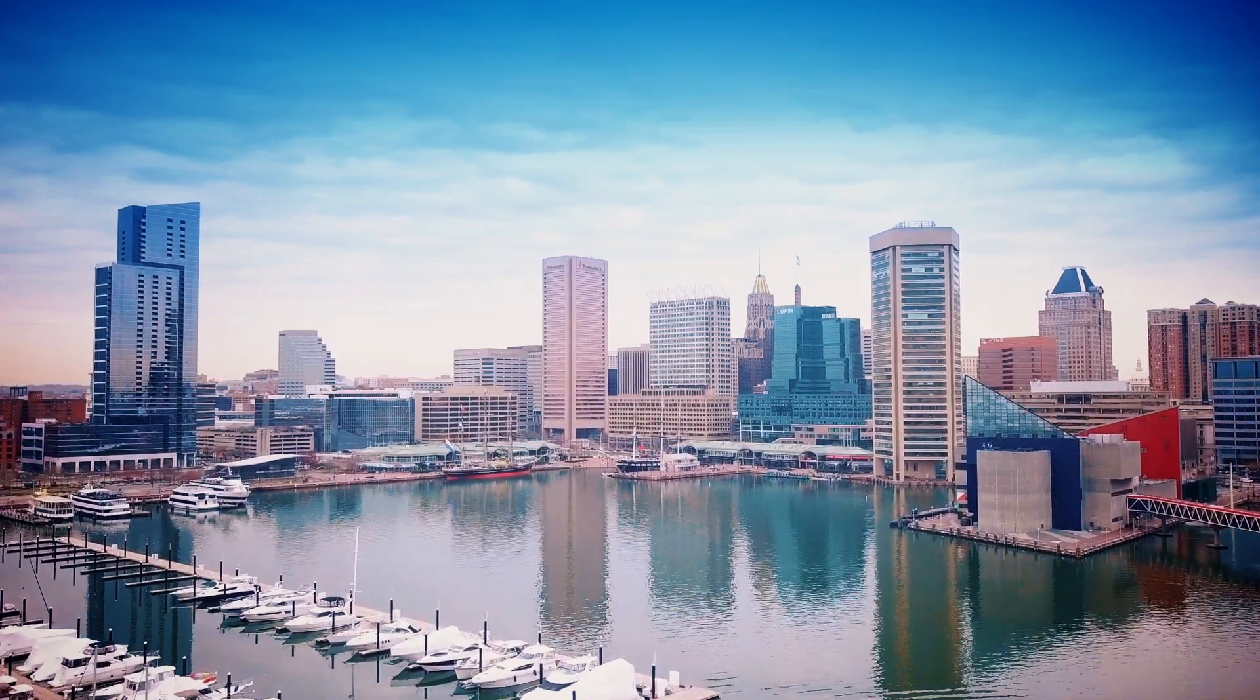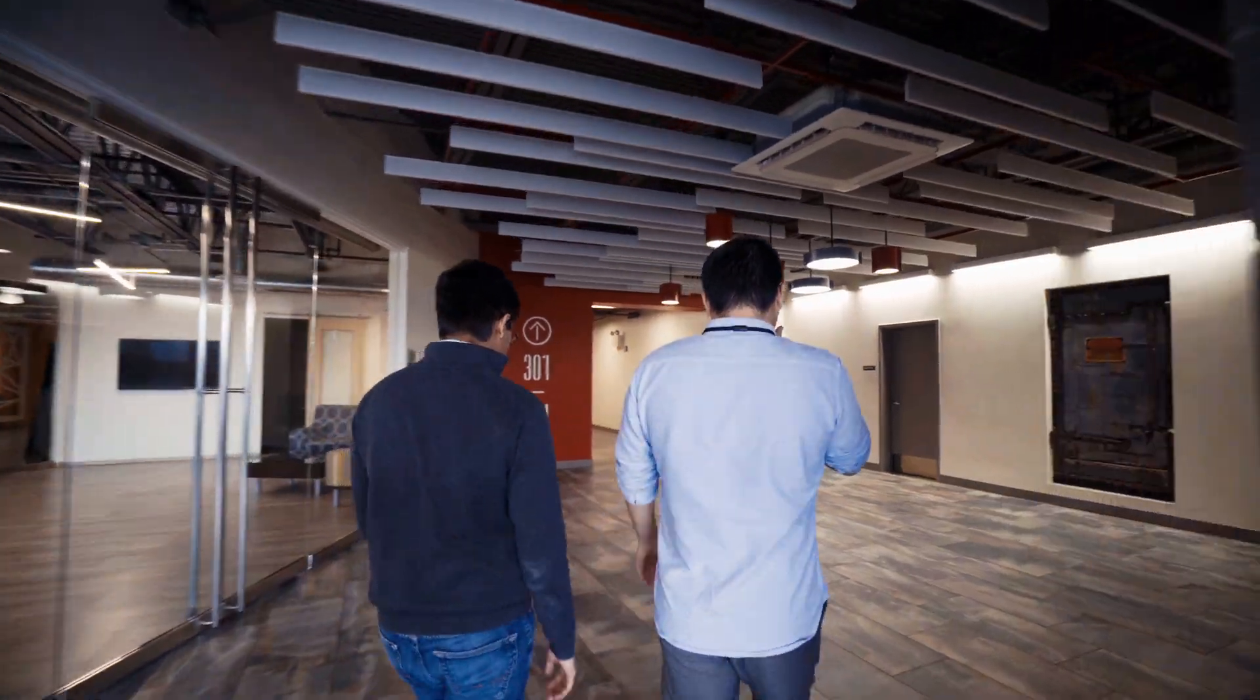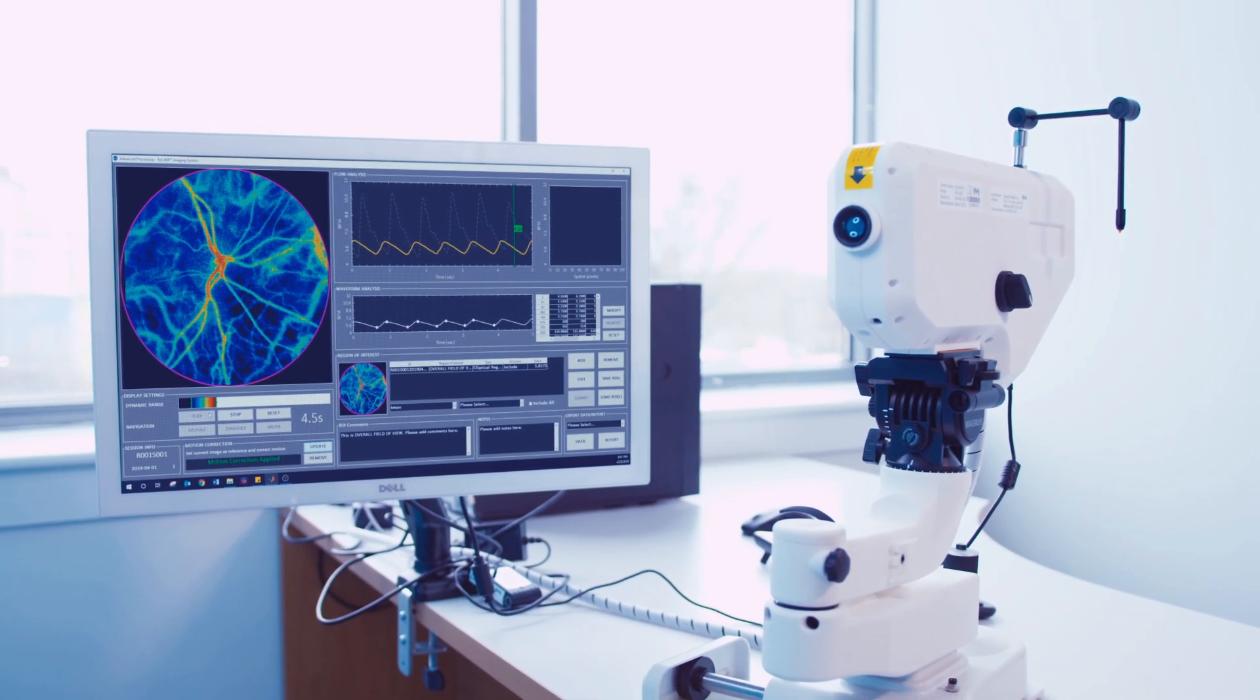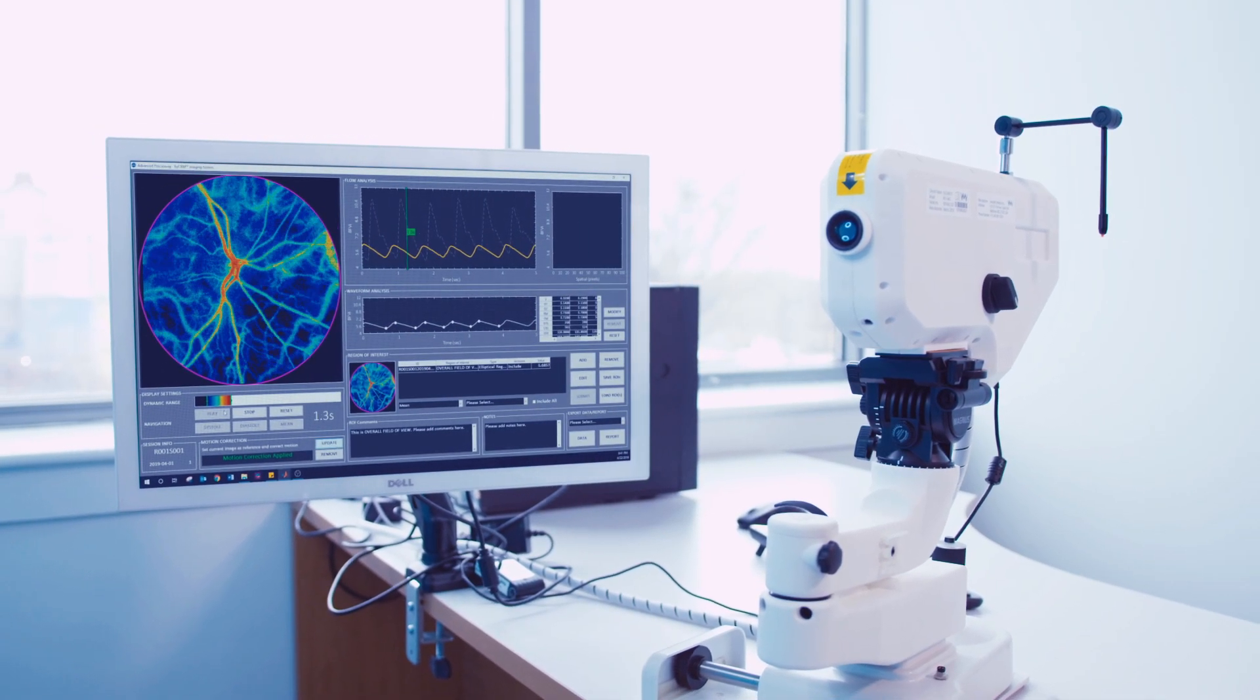In Baltimore, Maryland, researchers at Vaseoptic Medical have developed the Zycam-RI, pioneering the next generation of retinal imaging.